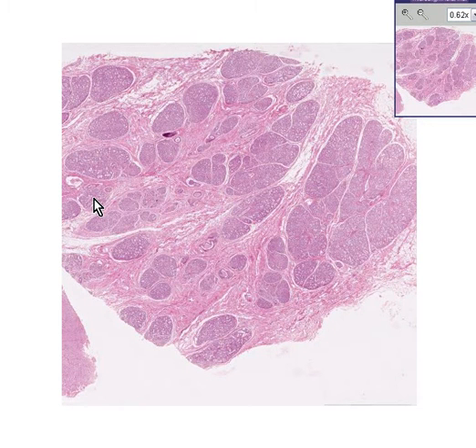Here is a slide of a breast in a pregnant woman. It's called hyperplasia of pregnancy. In a way, this is kind of a misnomer because hyperplasia is often thought of as being a reaction or abnormal reaction to some type of process. In this case, this is a normal breast that normally undergoes hyperplasia with pregnancy.